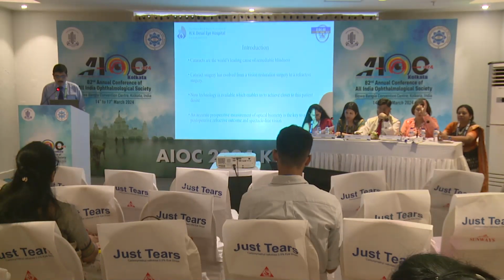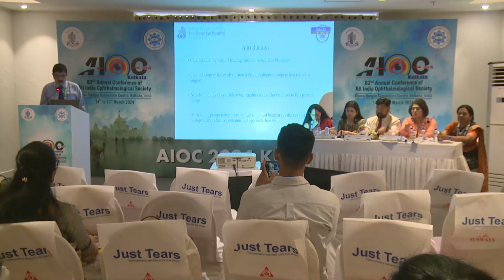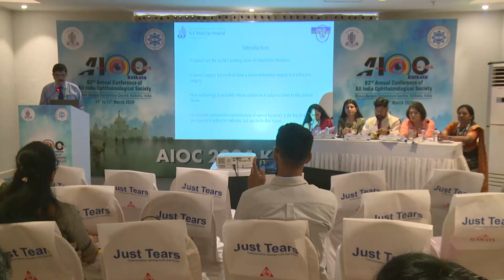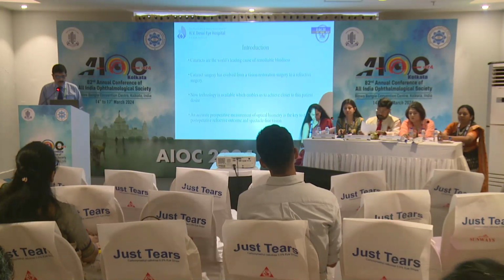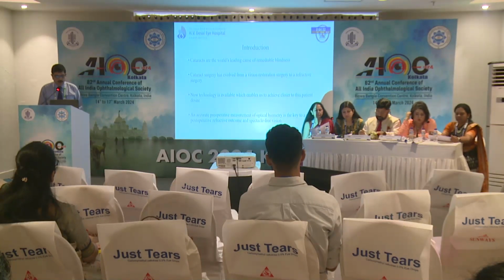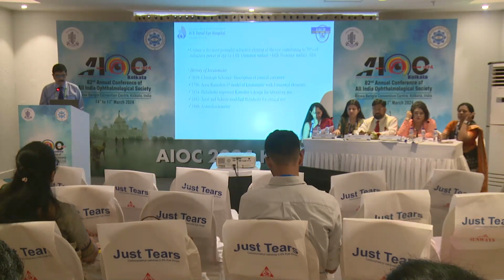Cataract, as we know, is a leading cause of remediable blindness. Cataract surgery has evolved from what used to be just a vision restoration surgery to a more refined refractive surgery. Technology is now available to reach this goal. An accurate pre-operative measurement of optical biometry is the key for a precise post-operative outcome.